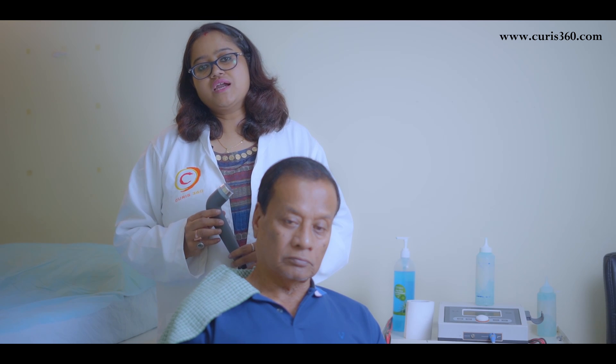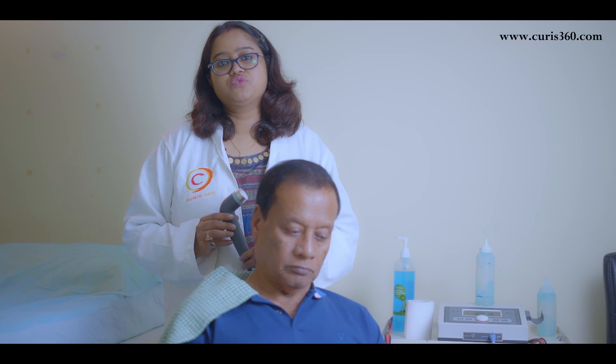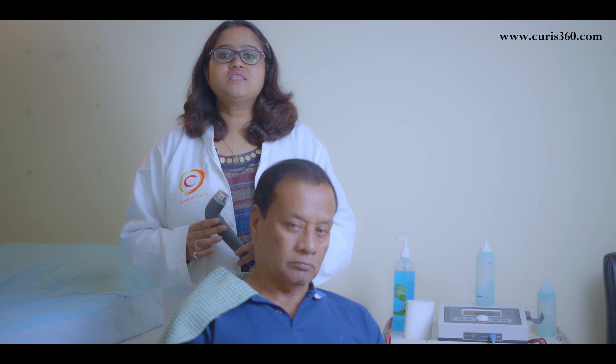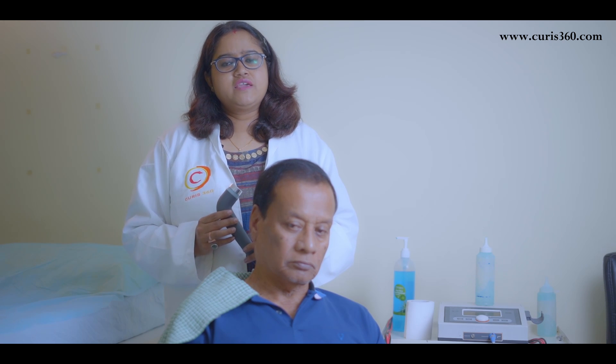This therapeutic ultrasound is used by physiotherapists and it is extremely useful to bring down chronic and acute pain. It can also be extremely useful to improve blood circulation to that area, which gives a huge benefit to recover faster.